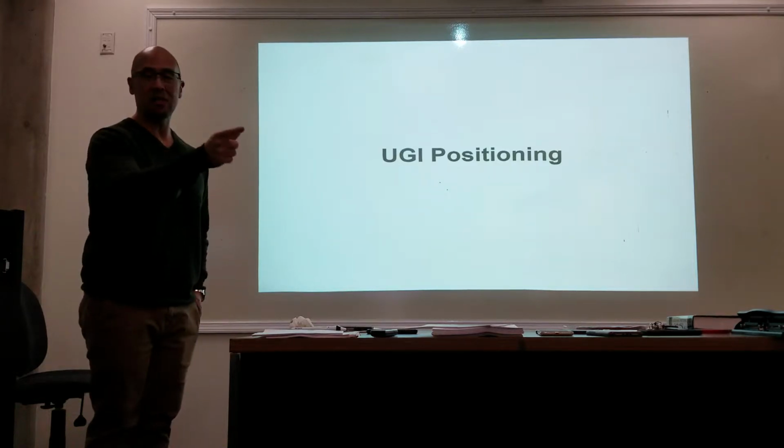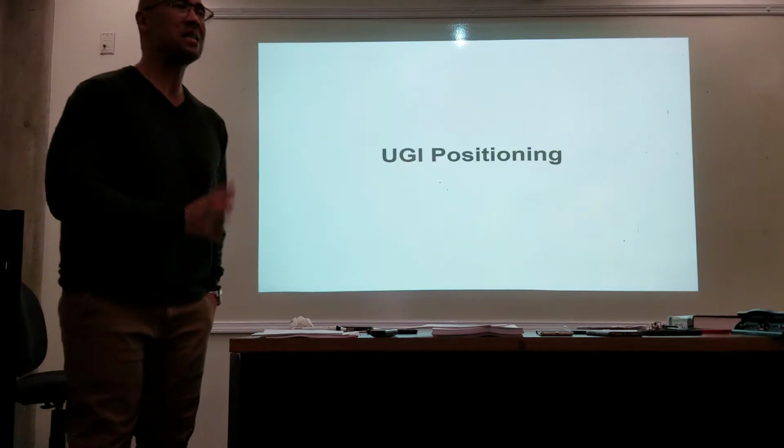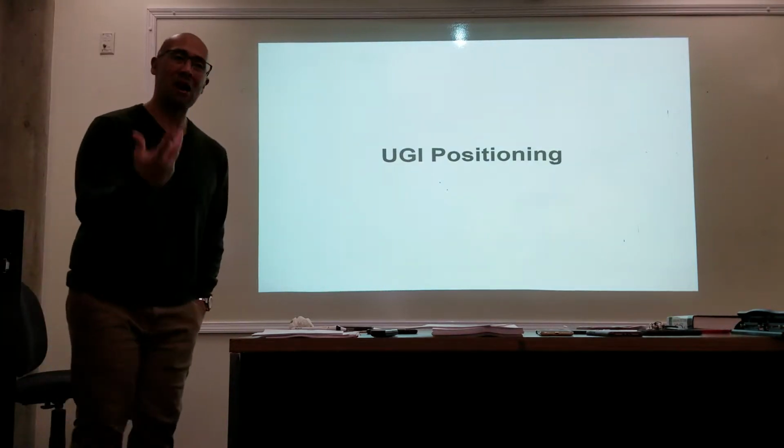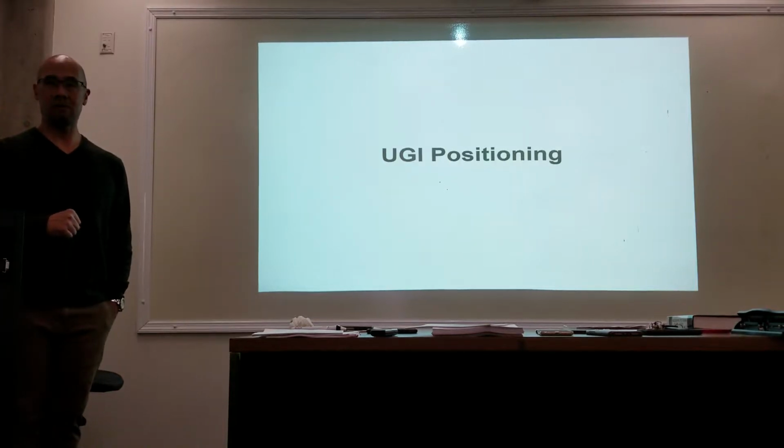So, again, the patient is going to be rolling around in different directions. The doctor is taking his spot films. When he or she is done, now you're going to do your overheads. These are the overheads. Ready?